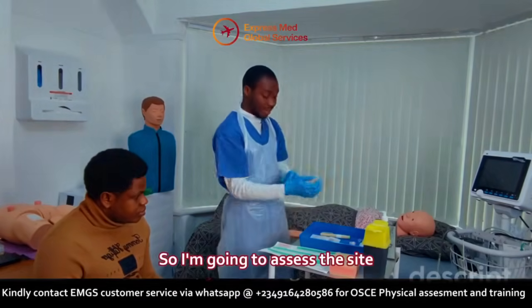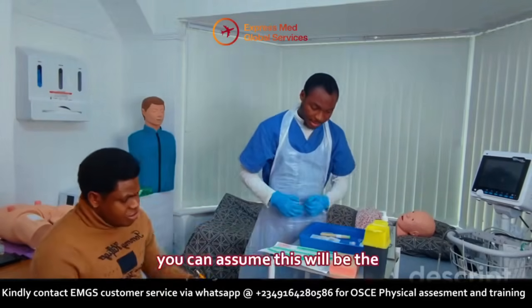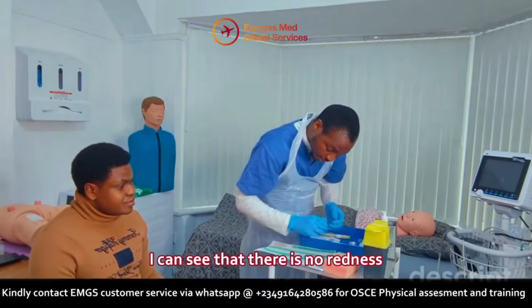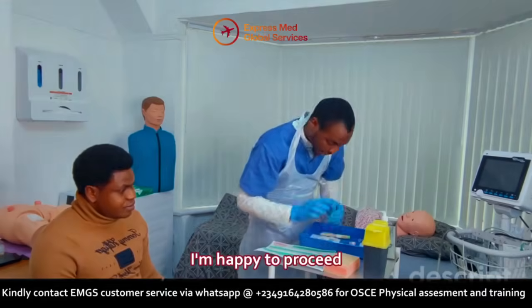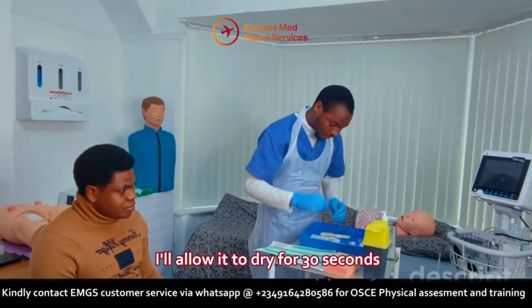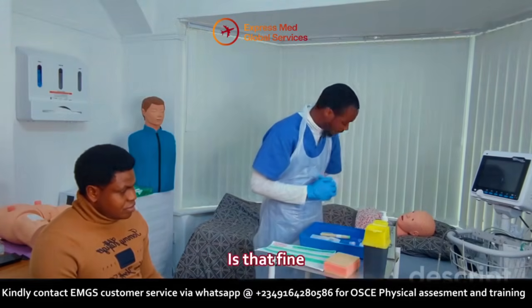So I'm going to assess the site now for signs of infection. Yeah, you can assume this will be the upper arm. Right, thank you. So I'm assessing the site. I can see that there is no redness, no swelling, no bruises, no signs of infection. I'm happy to proceed. Had it been necessary, I'm going to clean it with my cleaning wipe for 30 seconds and allow it to dry for 30 seconds. But since it's visibly clean, I'm going to go ahead and give the medication. Is that fine? That's fine.